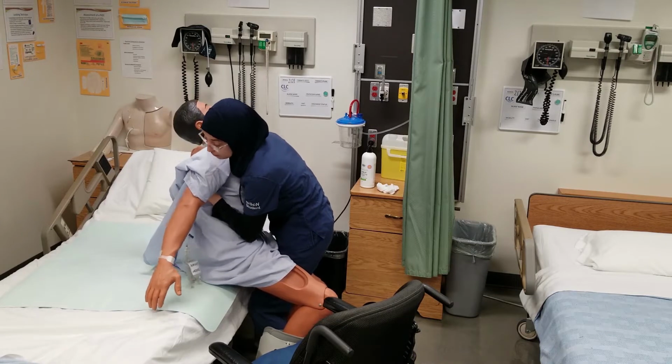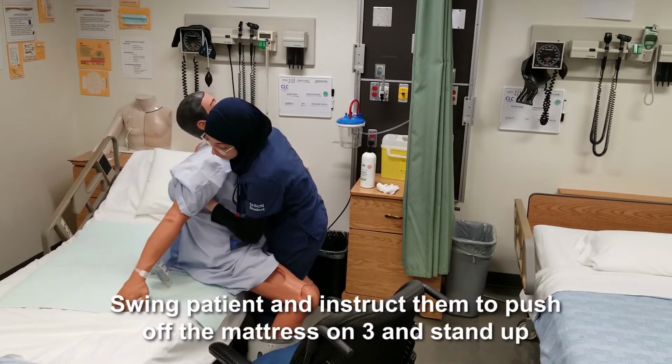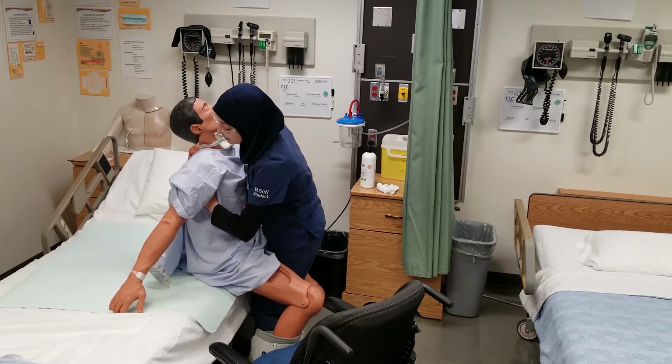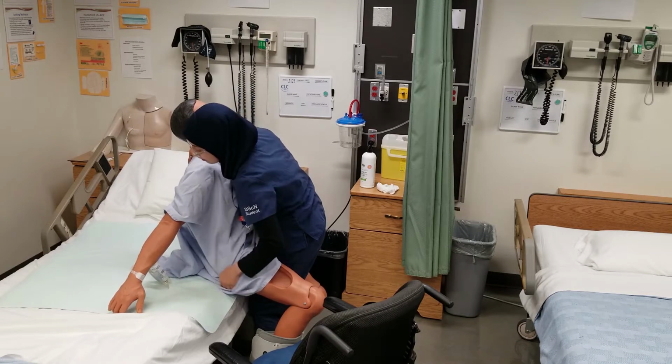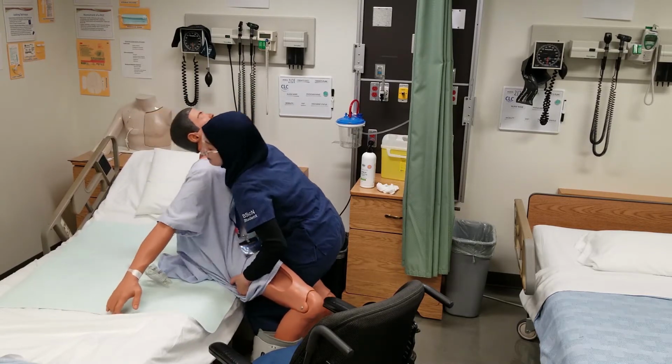So Chris, we're going to rock back and forth, and on 3, we're going to lift you up. If you're able to, put your arms on the bed, and I'm going to have you push off with your arms and stand up on 3, okay? Ready? 1, 2, 3.